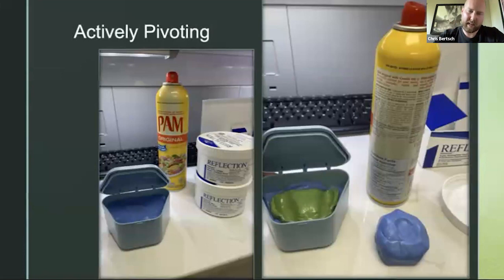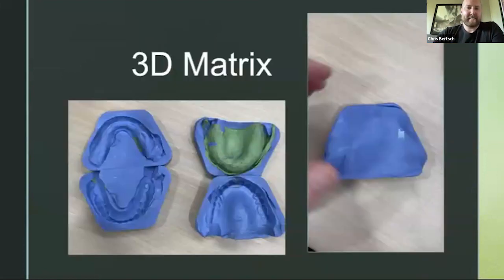And it's super important to have the PAM between the layers, because if not, you have to cut the denture out, and then it defeats the whole purpose because it looks like a massacre. So that's what it looks like. So there's a video.